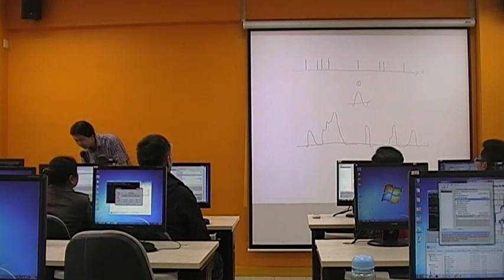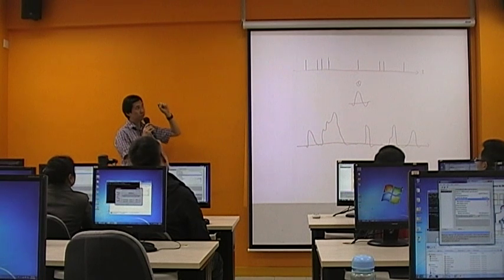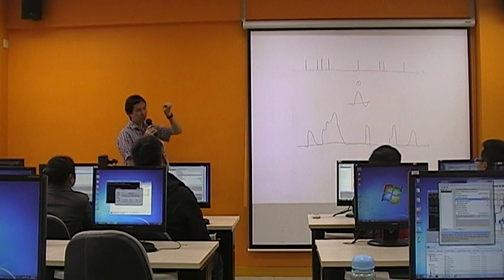And the micro time onset is like, if you've done slice time correction, you are going to adjust your time course of all the slices to the middle, right?